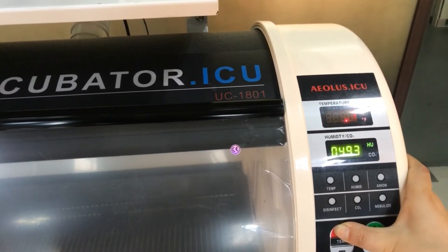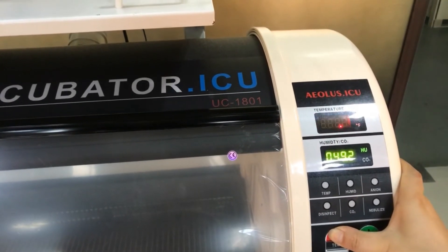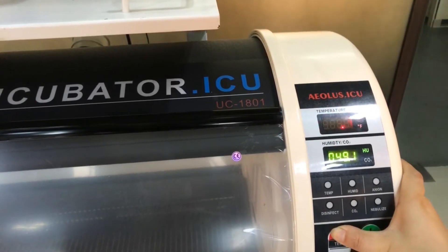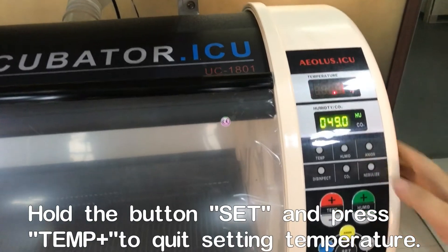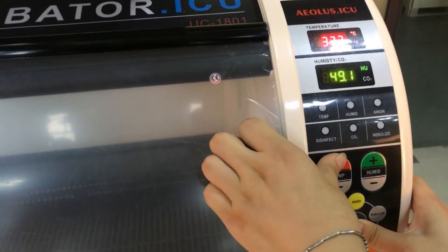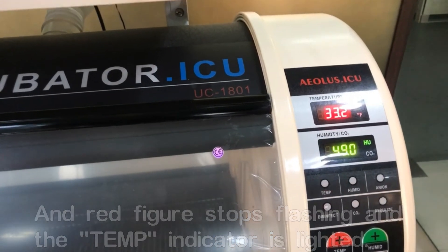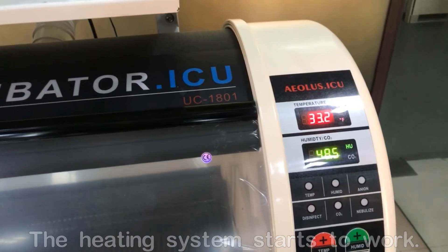We are going to set it up to 38 Celsius degrees. When you finish setting, you need to hold the SET button and the temperature plus button to exit the setting mode. Now the whole setting is triggered and you can see the temperature light blinking, showing you it's heating up.